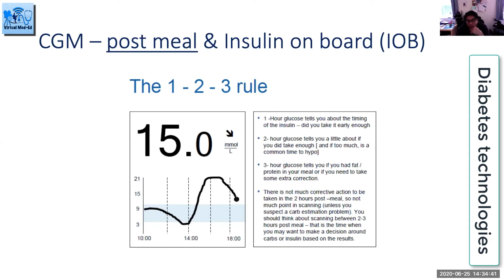I wouldn't intervene, because if you zealously correct here, you definitely get a hypo, and then you're having to recorrect, and you'll end up with a yo-yo effect. So again, sit tight, know your arrows, know where you are and how many hours after your meal. Think about insulin on board, and you must be able to explain this to a patient in a non-jargon way. And I quite like using pictures and graphs and explaining to them how it works.